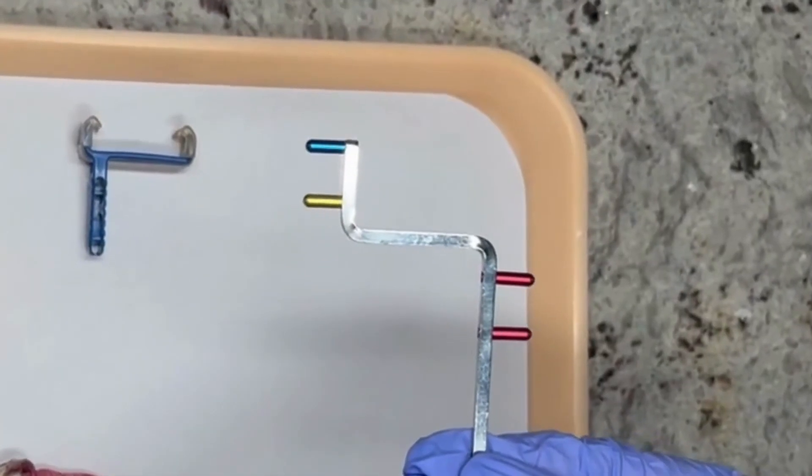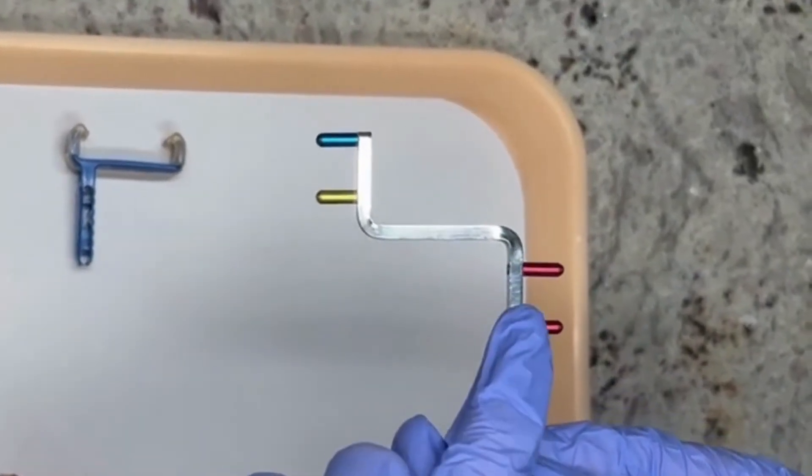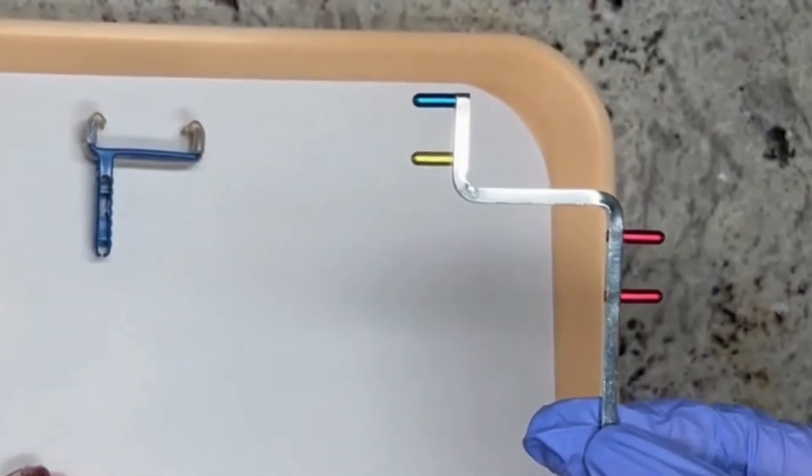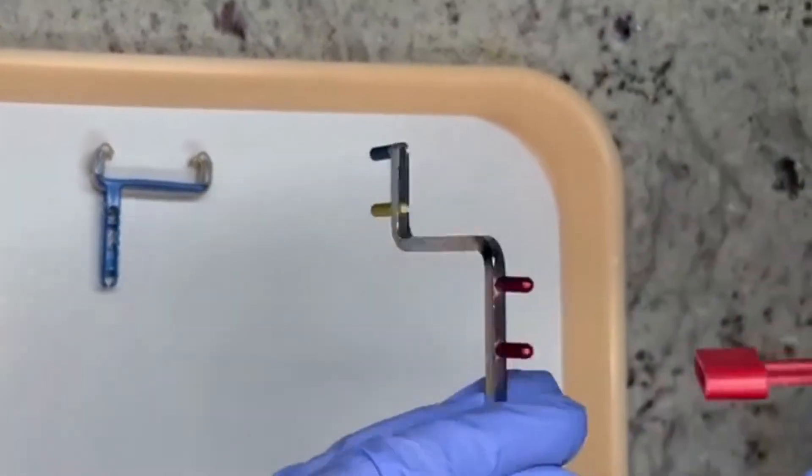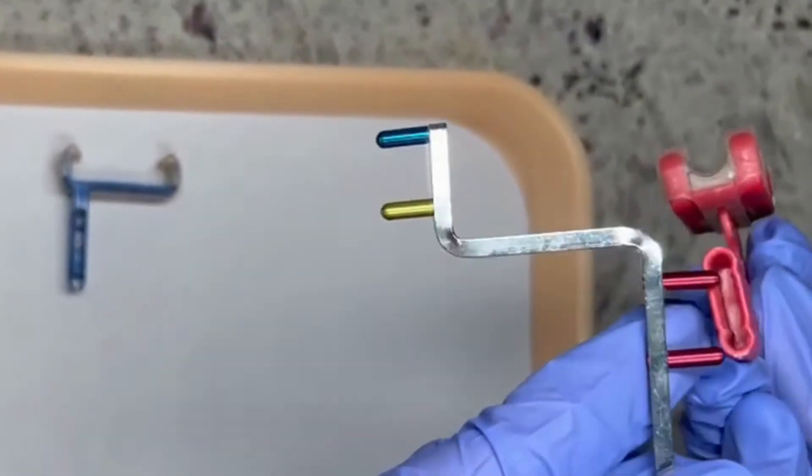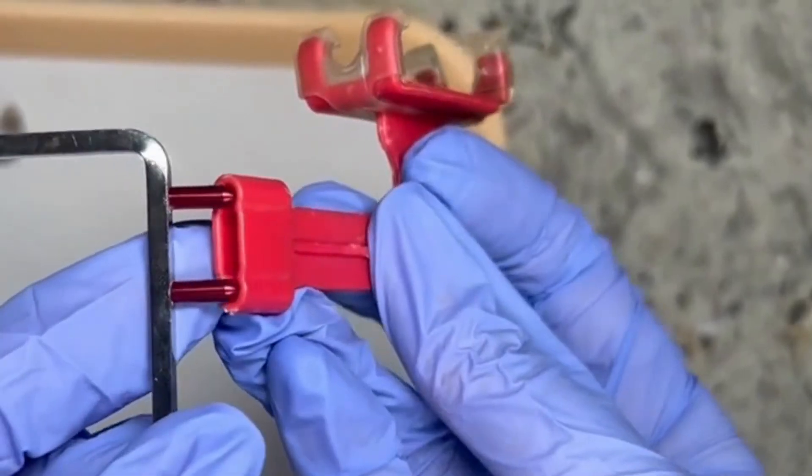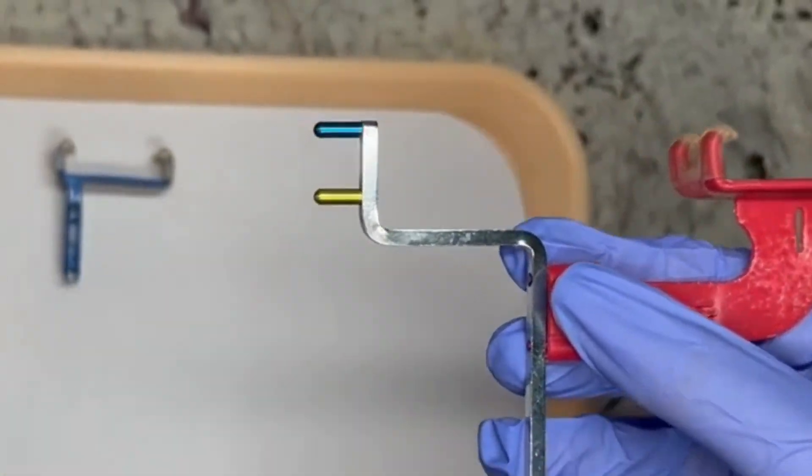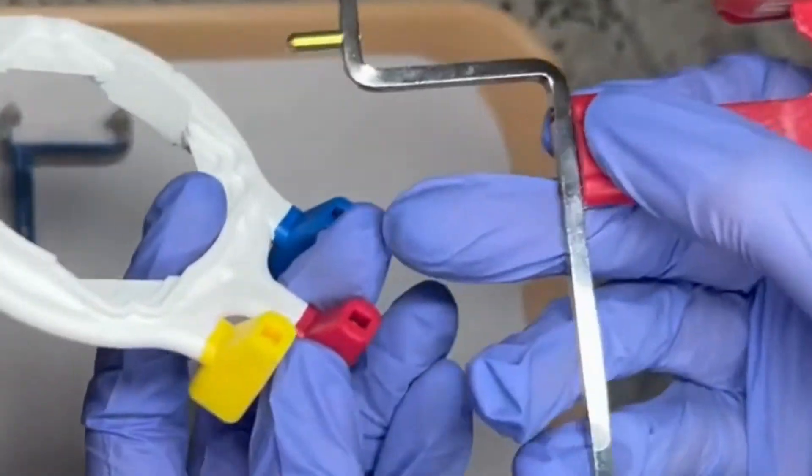Finally, for the bite wings we are going to use this portion of the arm right here. We're going to put it in this part, grab our bite tab and make sure that we line up these two parts. Then we're going to grab our ring and put the arm in the red portion.